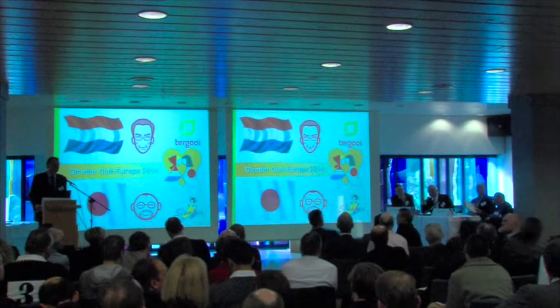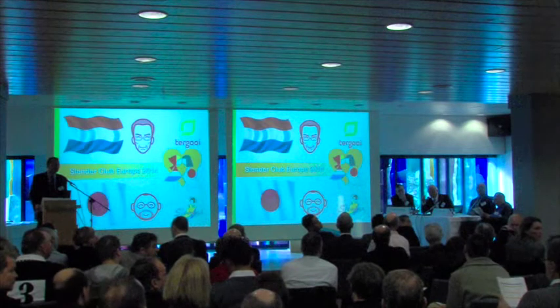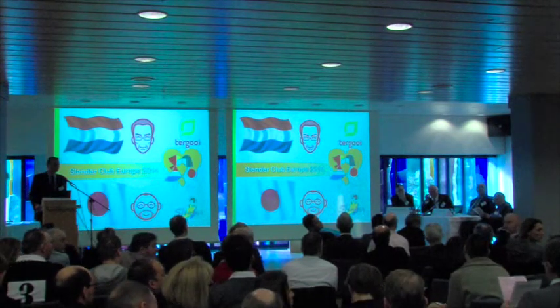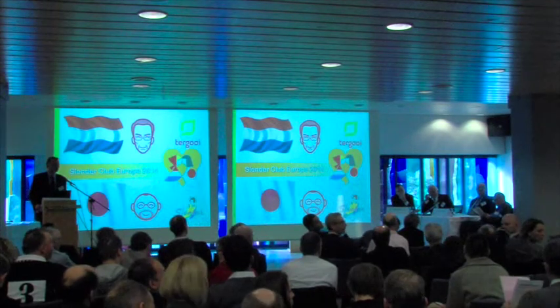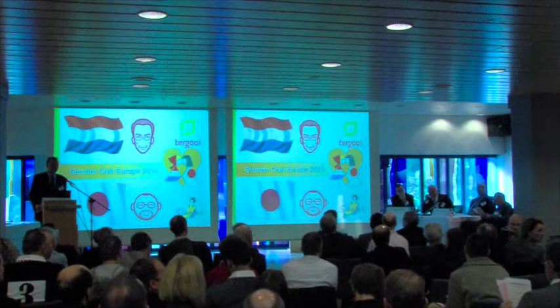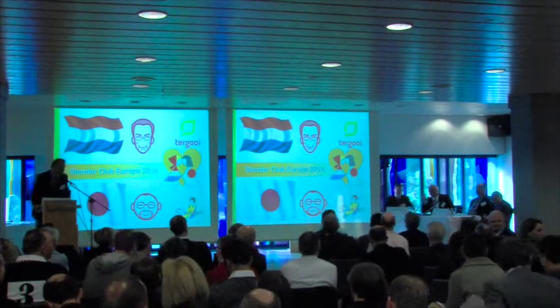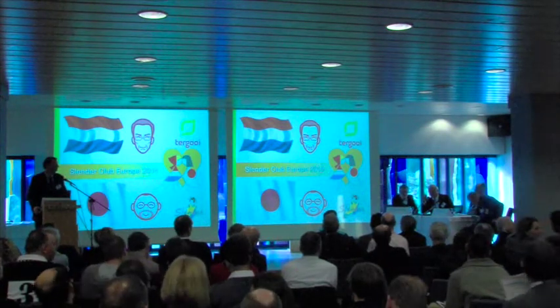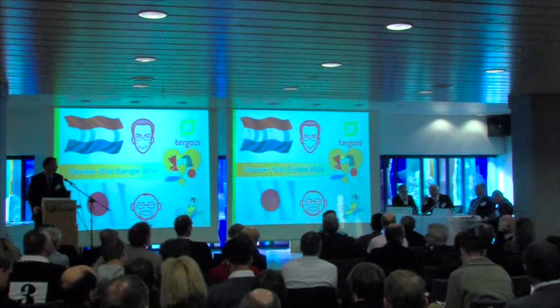What is the company? Do you have to put it on the balloon yourself, manually? No, it's just a normal pre-mounted single-layer covered stent. I don't know this one. I think you can see outside. Okay, because the one we have in my center is a double layer, impossible to put on 5 French. Sometimes also impossible to put in some distal lesion or a complex lesion.